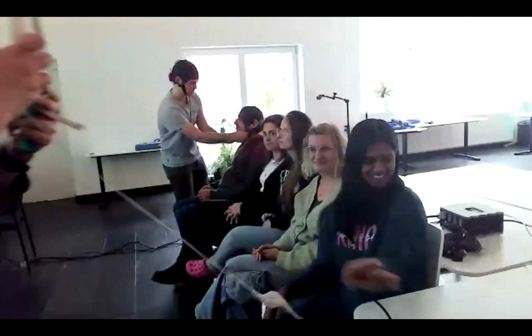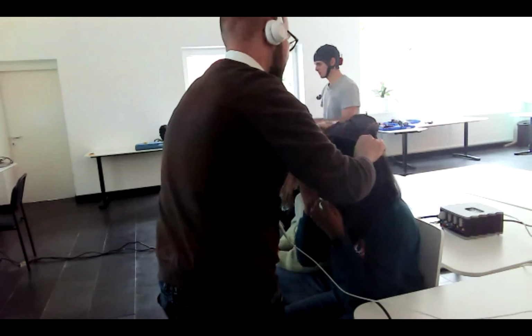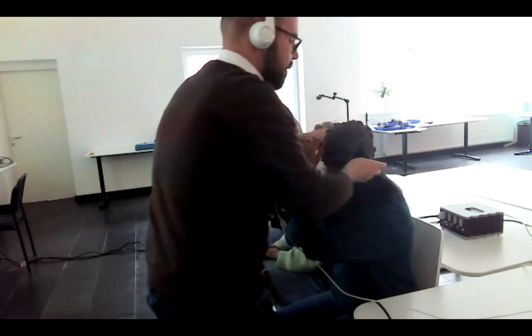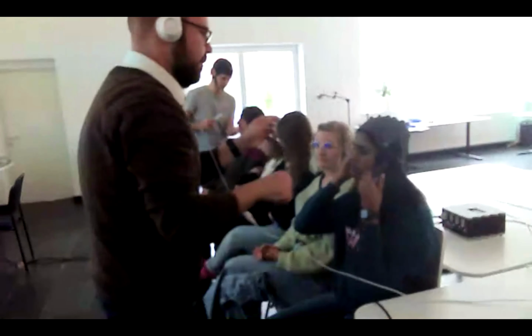Always complicated things. And we have then an 8-channel cap on our head. So if you can help me just holding the frontal part. Let me just see if people can see exactly. So very good.